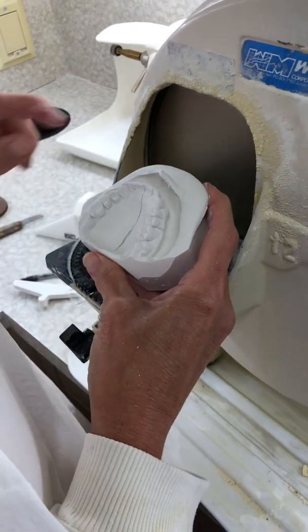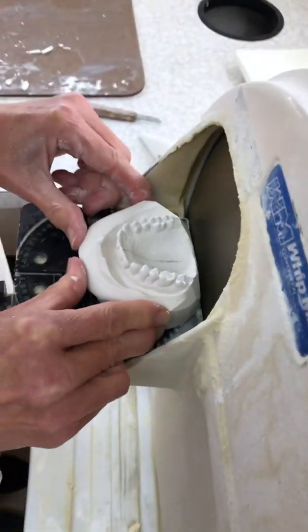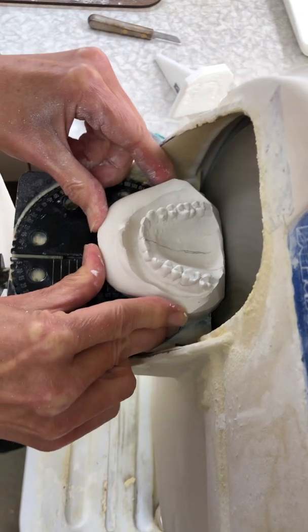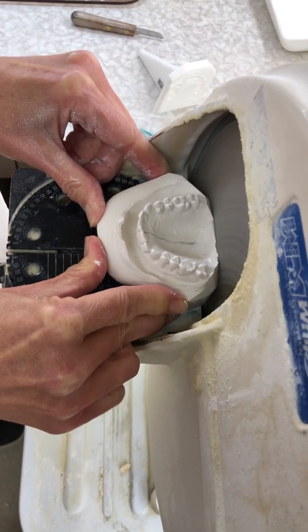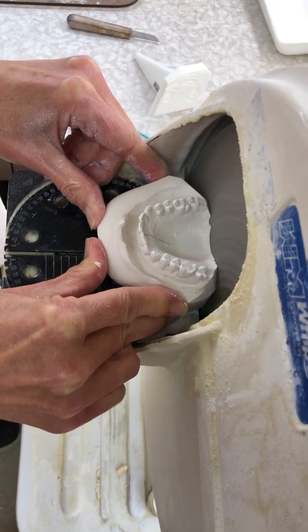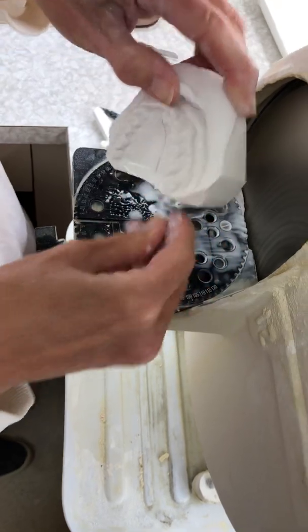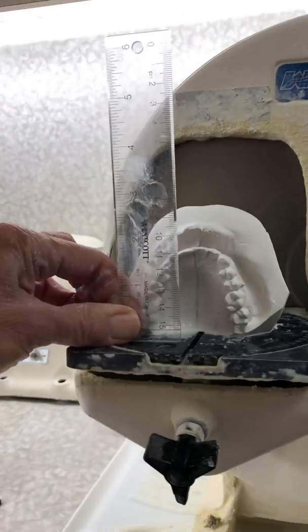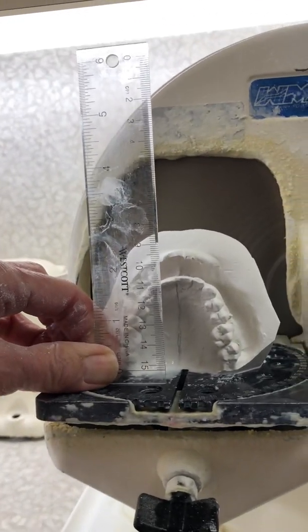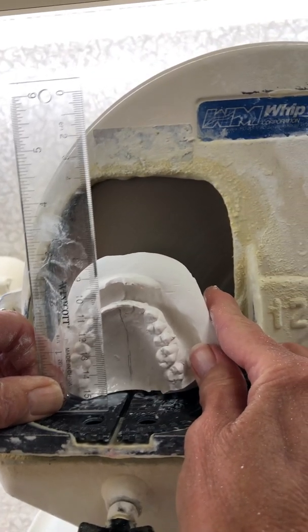So now we want that perpendicular. So what I usually do is I eyeball it when I'm coming in. All right, so that's a start for that. Now what I'm going to do to make sure, sometimes I don't trust the eyeball, so I look, and you can see that we don't have it yet. So to get it there, I need to just trim off that corner a little bit.